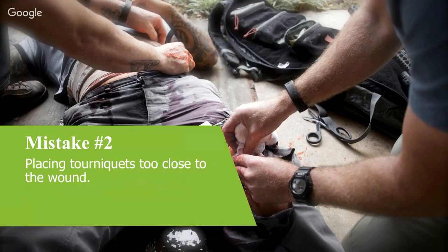So currently we've got 35% who would go high and tight as their go-to placement. And again, remember I said this is non-tactical. So we've got about 65% saying they're going to go just above the wound.